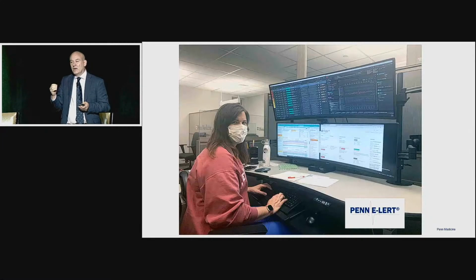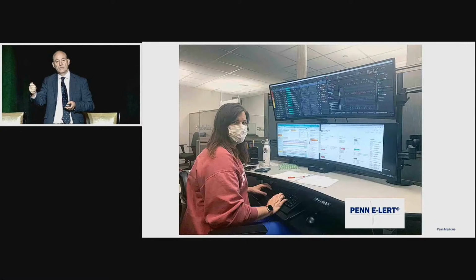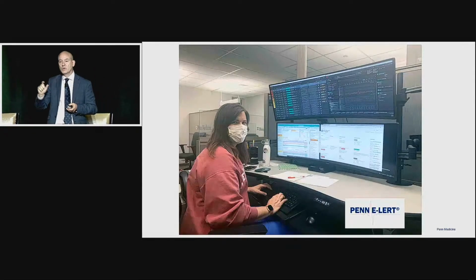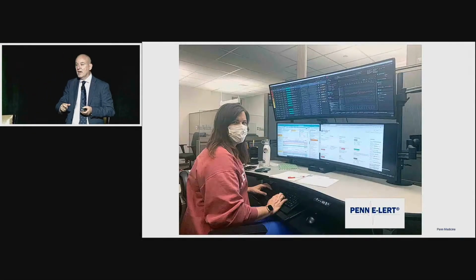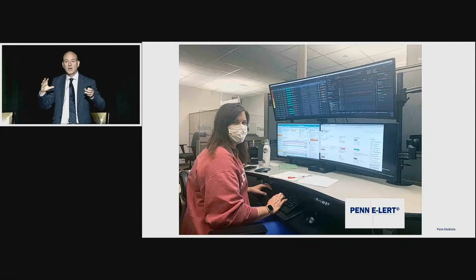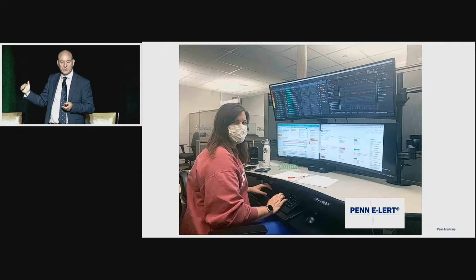I always remember this, the craziest thing we had back in the UK: they started to say that we needed to have all anesthesia syringe labels the same color so that you read the label. And I kept saying, well, we're very visually oriented animals, we're color based. So red is good for muscle relaxants because it kills people. You're color based, so you shouldn't be reading. That's basically how we've designed this interface, so that everything is just a delta and a color. You don't actually need to know the value. You know that something bad is happening to the patient.